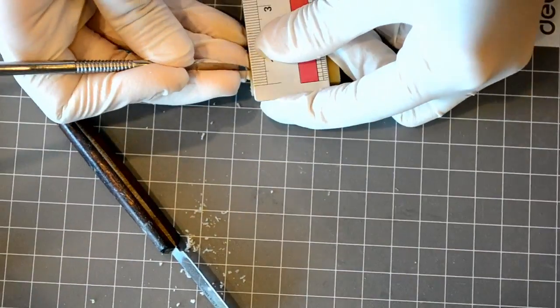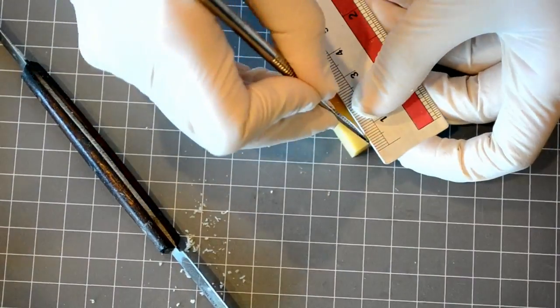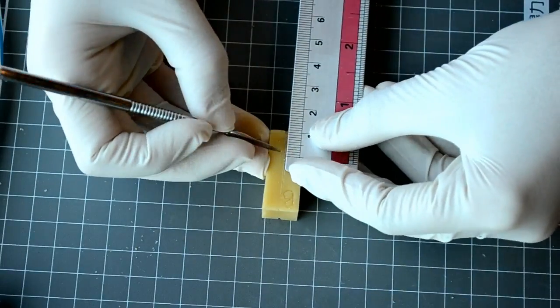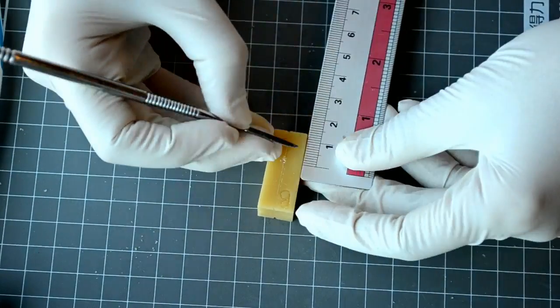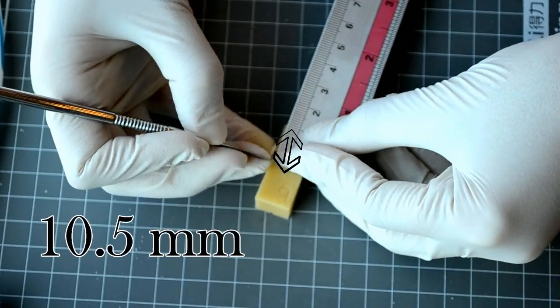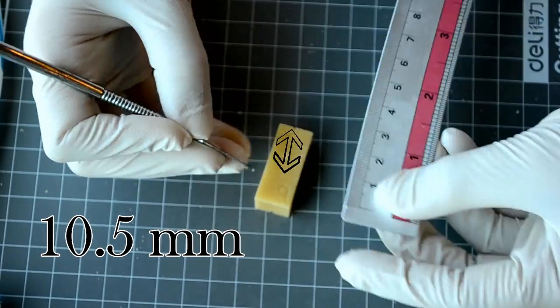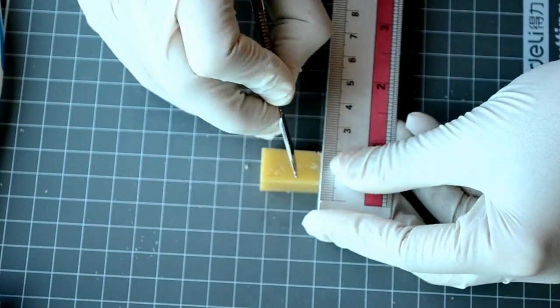Now you can start placing your measurements on each aspect using the Le Cron carver and ruler. Let's start with the buccal aspect. Using the incisal edge of the wax block as reference, measure 10.5 mm at the center of the buccal aspect to mark the length of the crown.